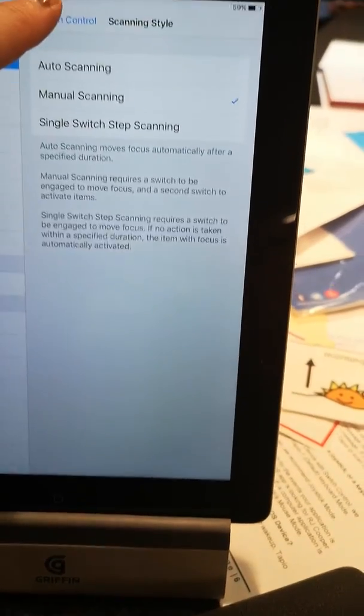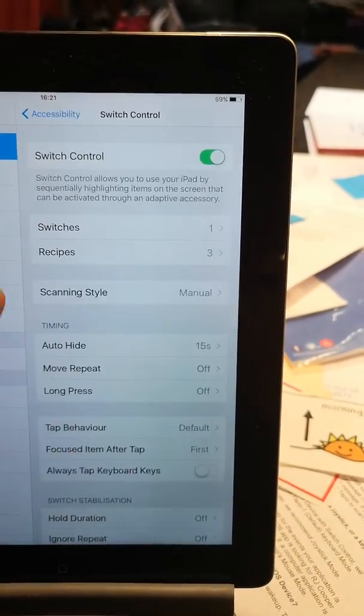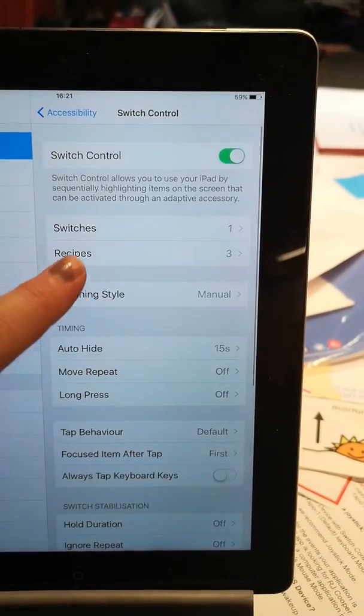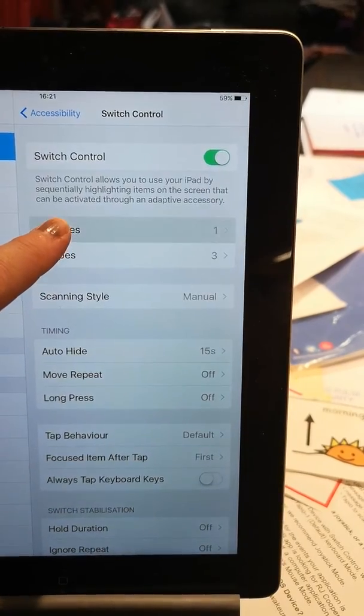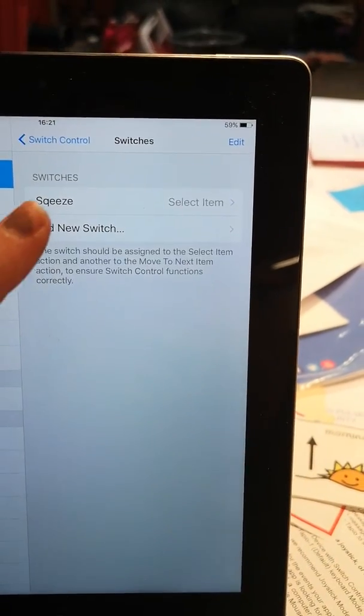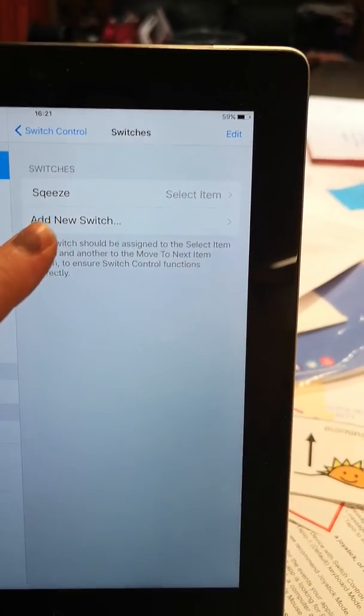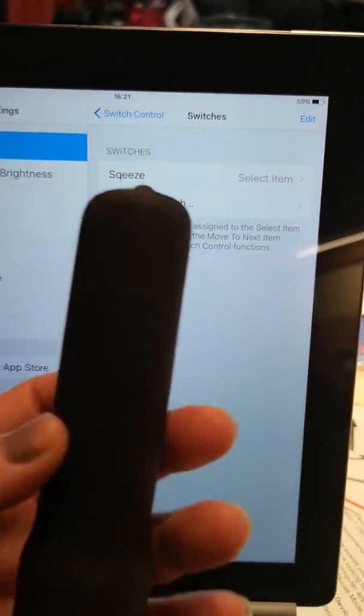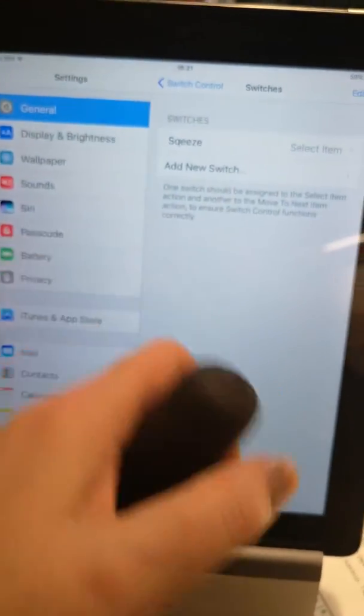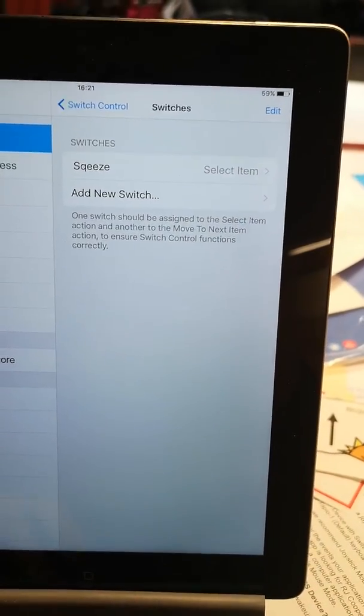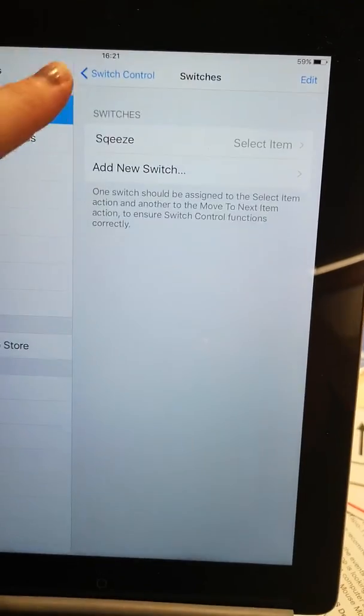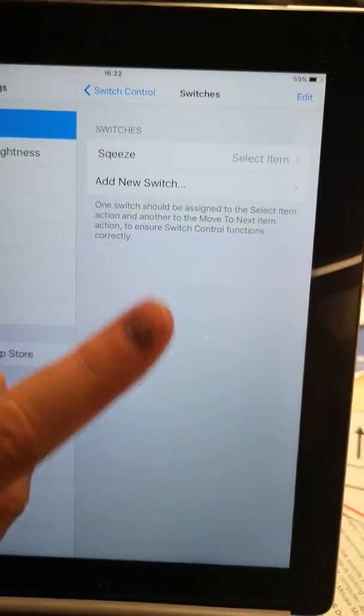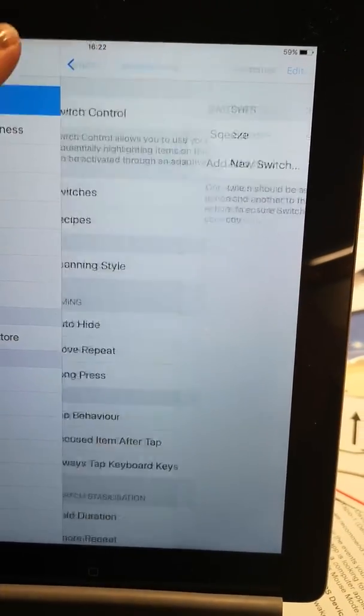So I'll come back out onto the main bit and the switches, I already have the, I've called it the squeeze switch because you squeeze it to operate it and where you can add new switches. But I'm only using one switch at a time at the moment. We're just trialling it.